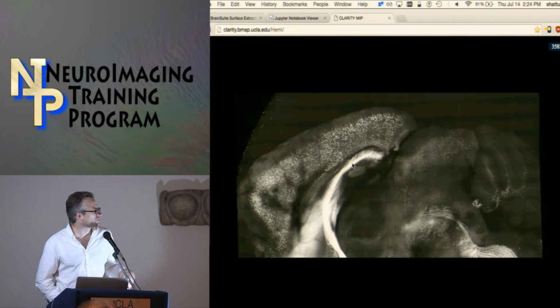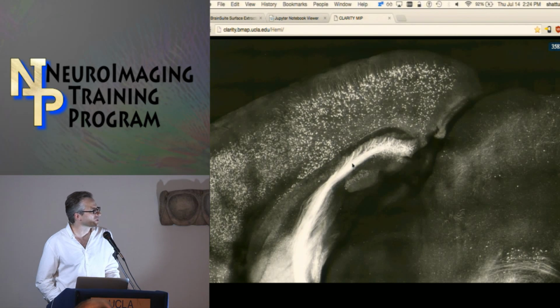So that's pretty exciting. We're still at a very early point in what we're doing, but we have done some work to cache images when we're in BrainSuite, so we can have data sets that are a few hundred gigabytes on disk that load fairly rapidly in the viewer. That's something we're hoping to get out in the next year, probably as a separate tool from BrainSuite, but based on some of the similar concepts.